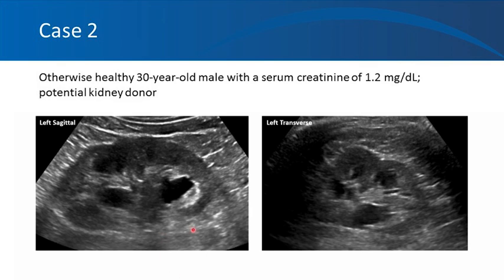Here you see a sagittal view of the left kidney. The prominent thing you would observe here is that there is an anechoic lesion in the pelvis region. The question is, is it hydronephrosis? But probably not if you closely observe. This anechoic region is not in continuum. And you can also see it in the transverse view of the kidney, and you see there are two distinct anechoic structures that are well separated.